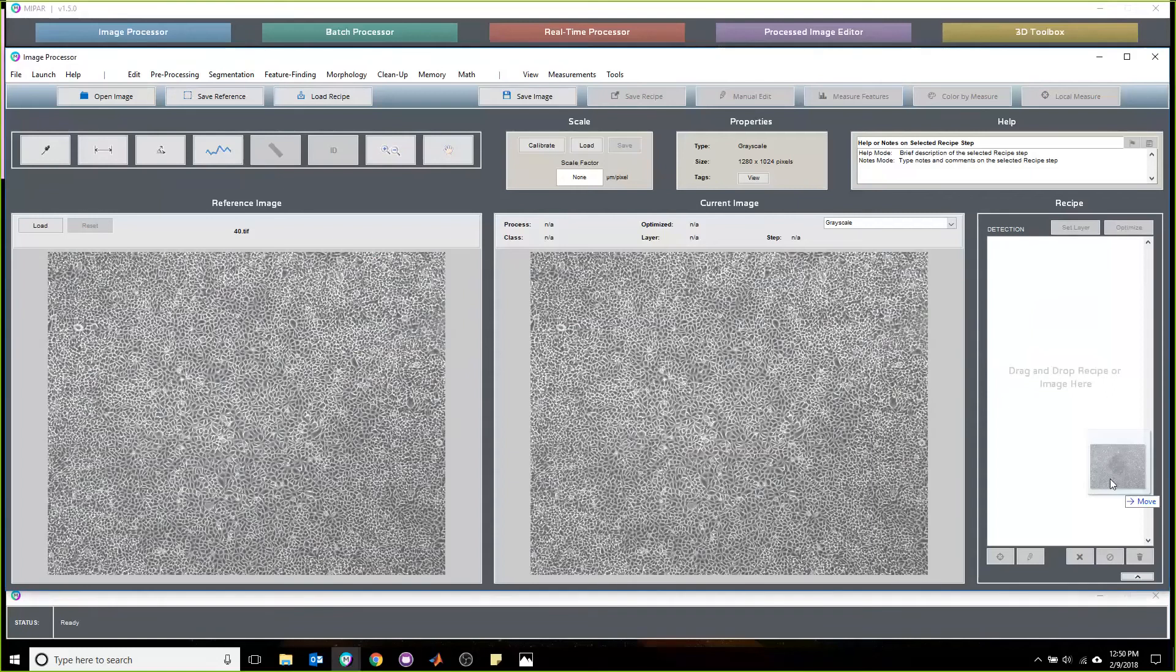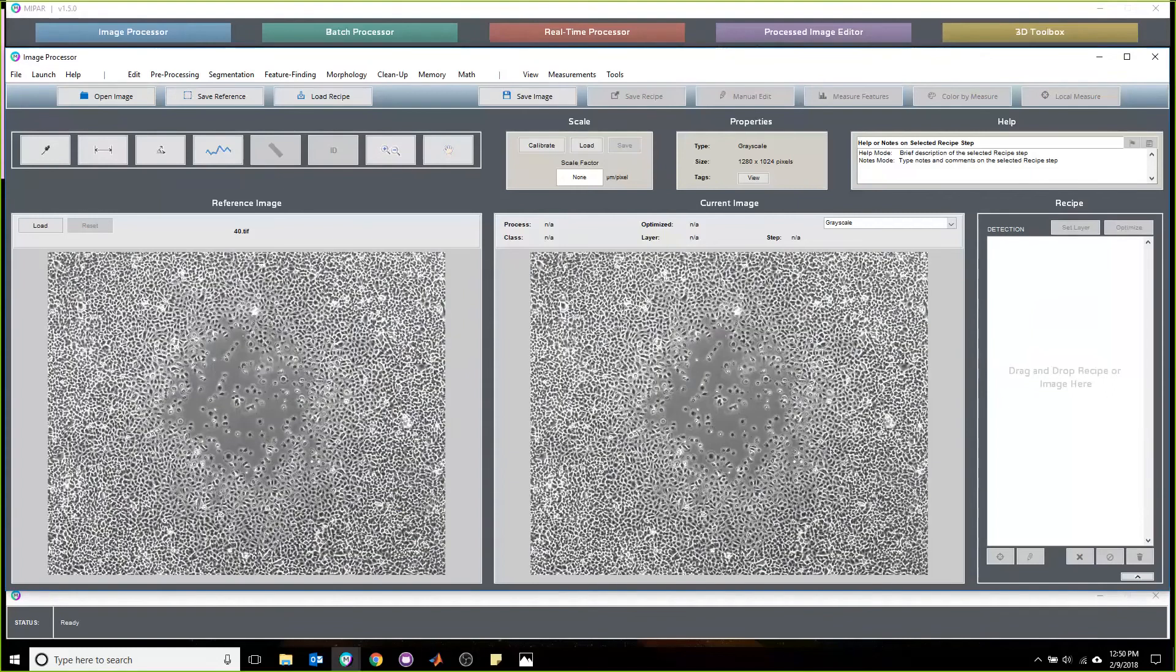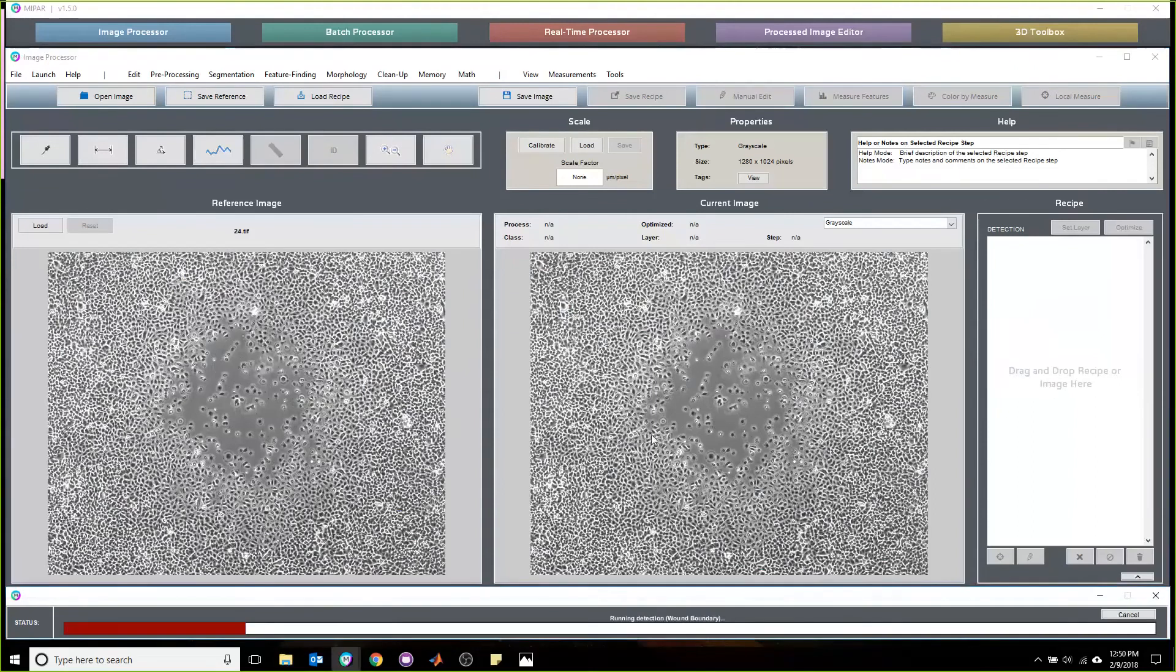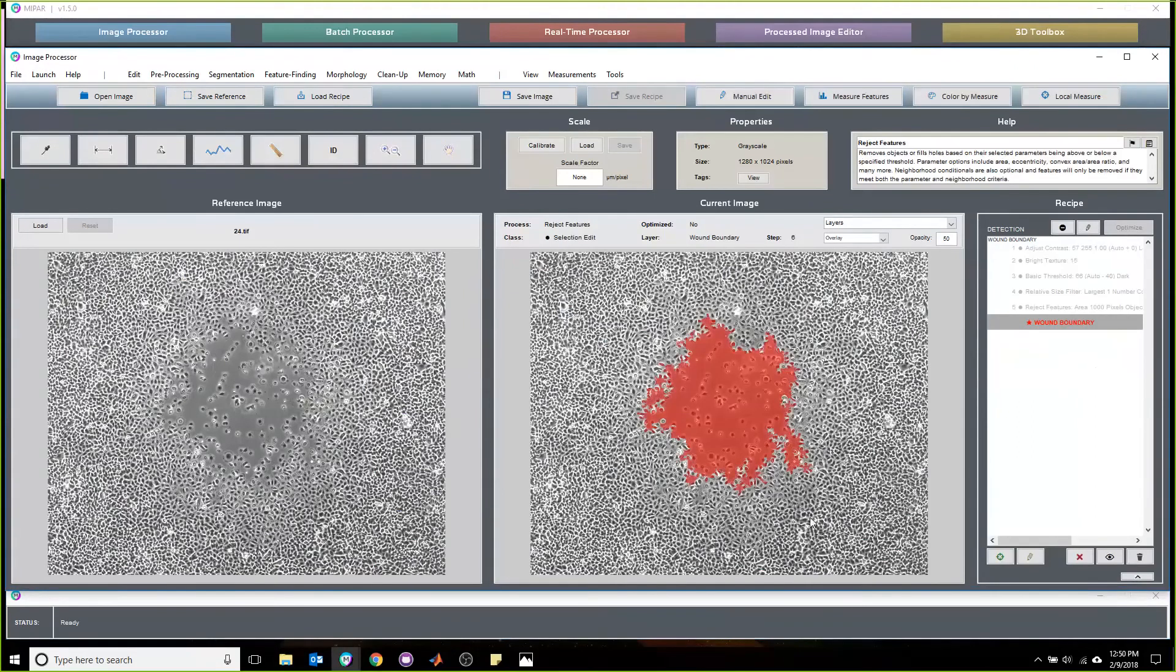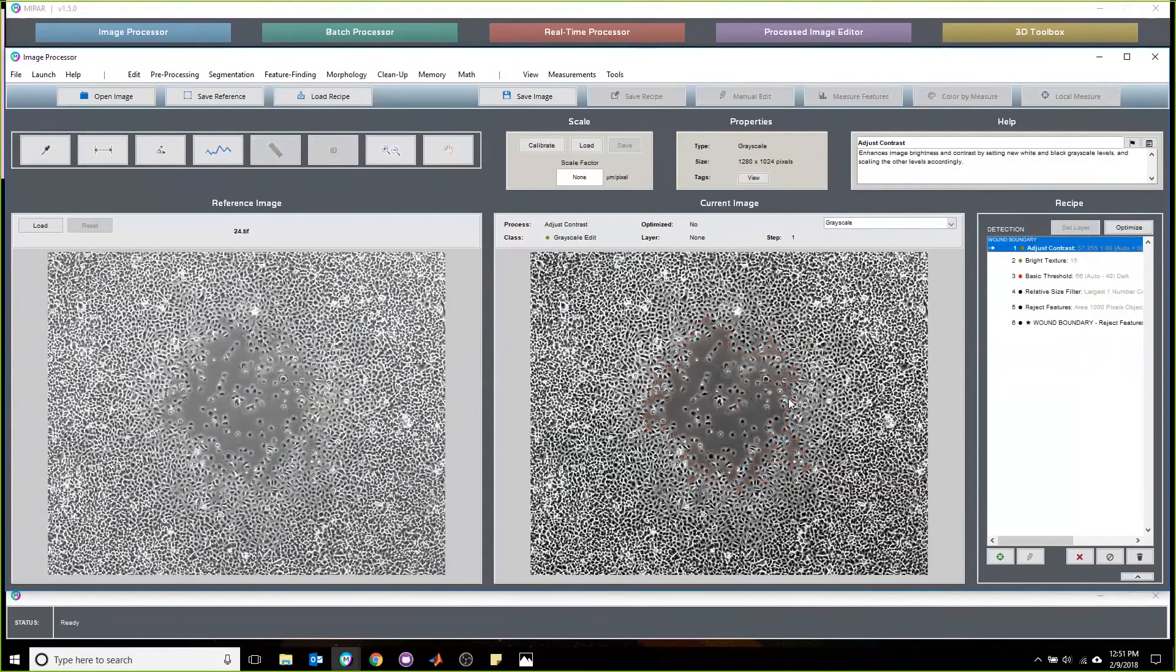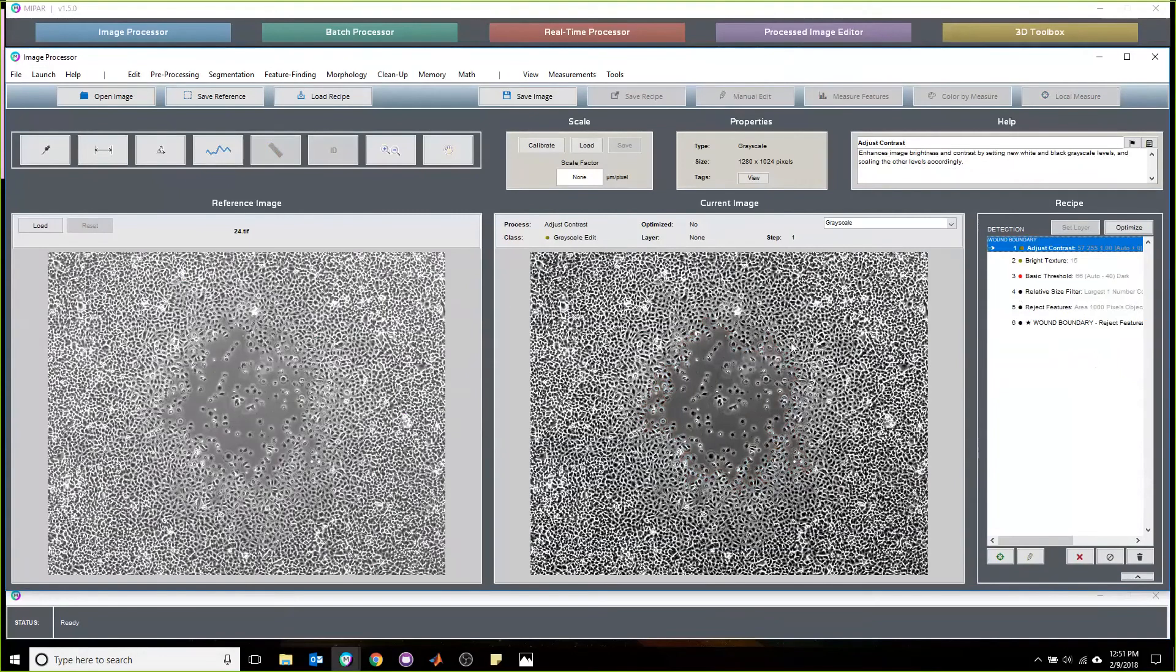For this application, we built a recipe that—let me just drag and drop this in here—is as simple as six steps long, but it's incredibly robust and able to pick this up consistently. I can demonstrate that now.